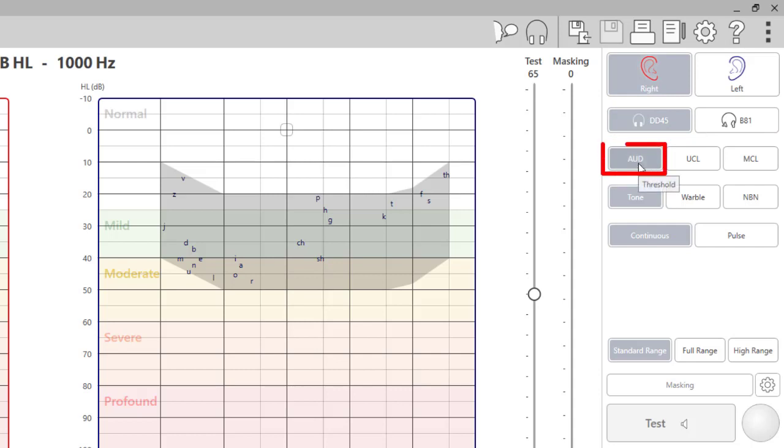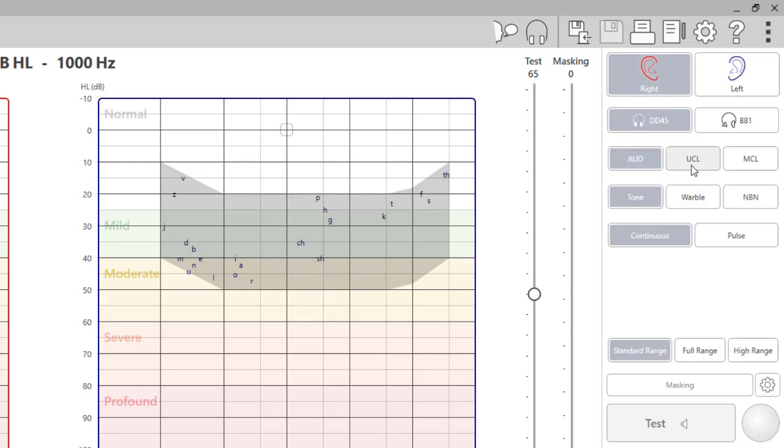Aud is selected for air and bone testing. For testing, MCL and UCL will be selected when performing those tests with tone. Please note, speech MCL and UCL will be completed in the Word Rec tab.